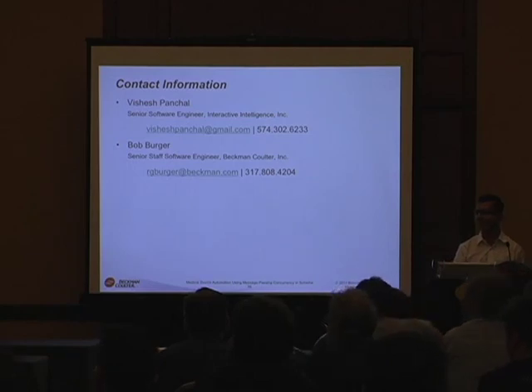Let's say that in your earlier example of the DSL, someone would, instead of cycle 40 times, write cycle FORTY. So then they execute their full DSL program. What happens machine-wise? We would give them a compile time error, essentially.